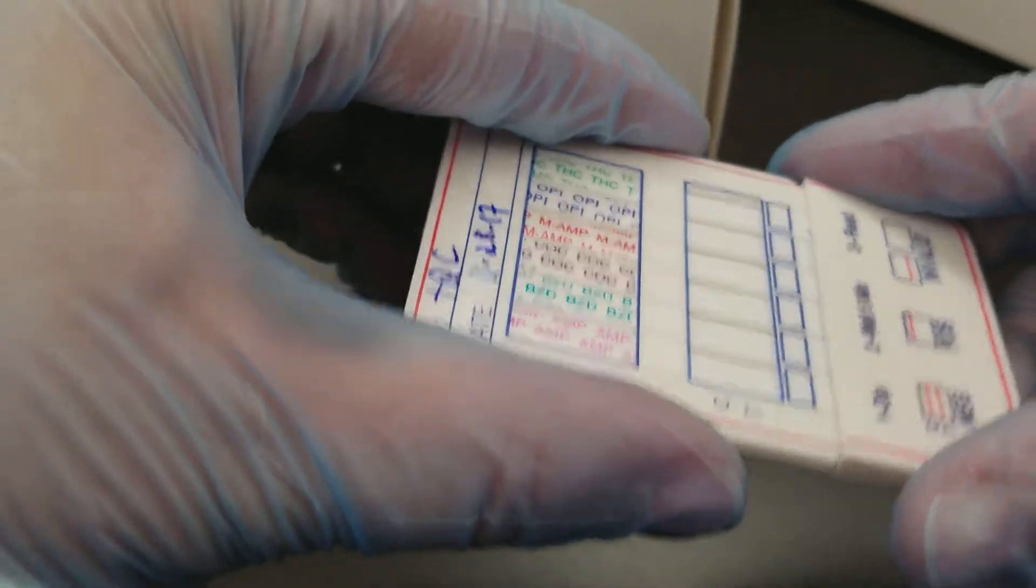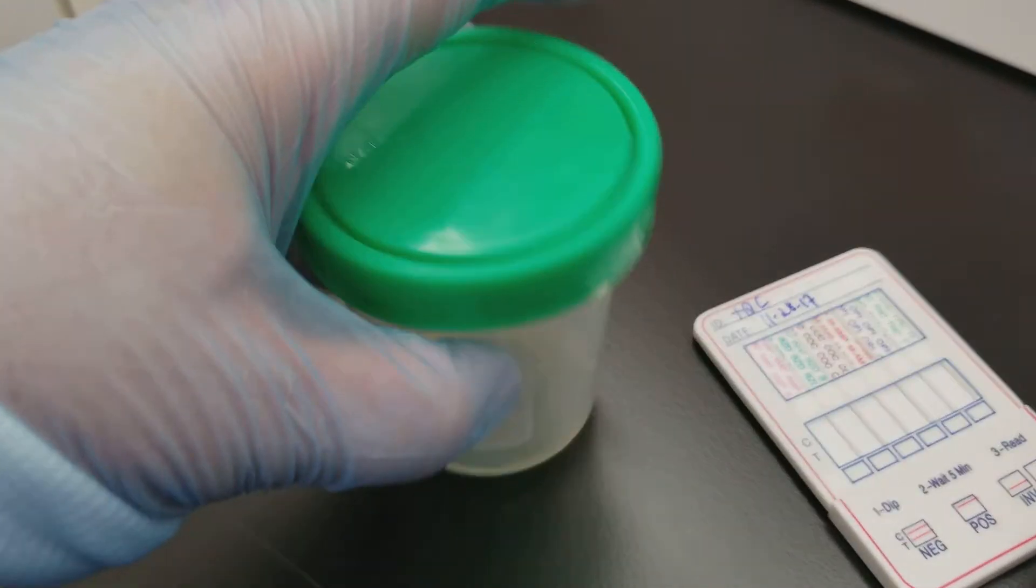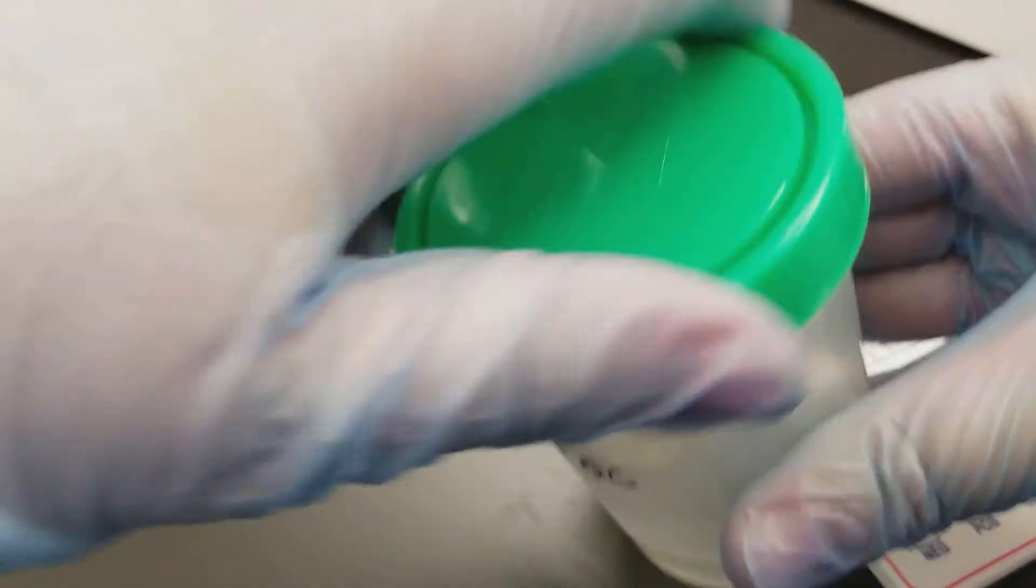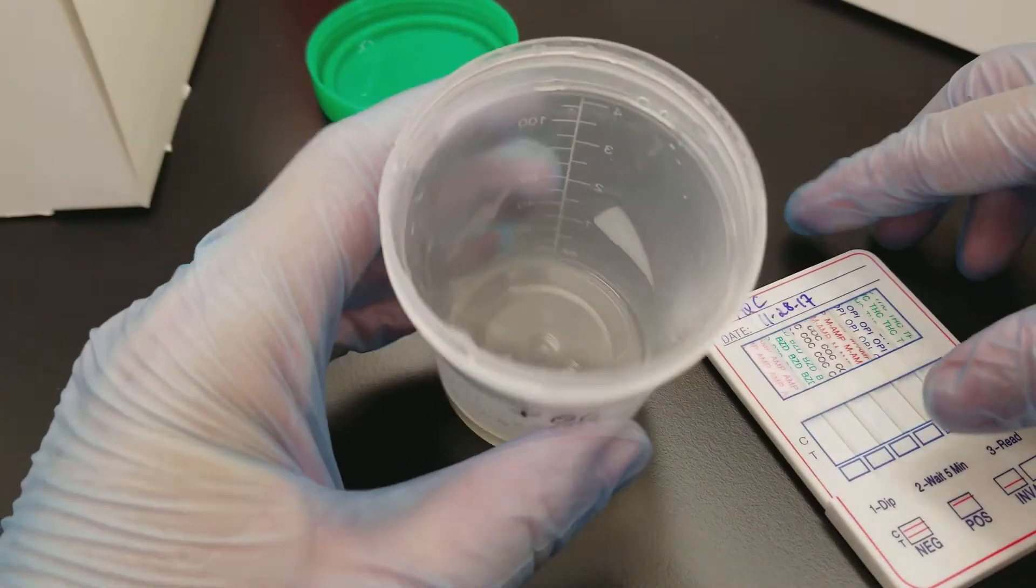We're going to get our specimen ready by making sure that it's swirled. The cap is off. Like I said, this is QC, so it's a very small amount in there.